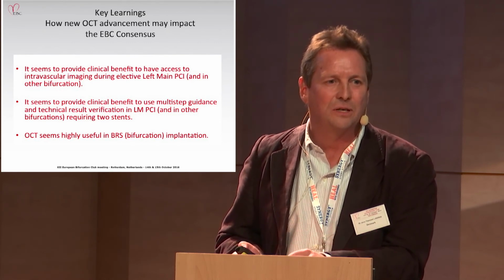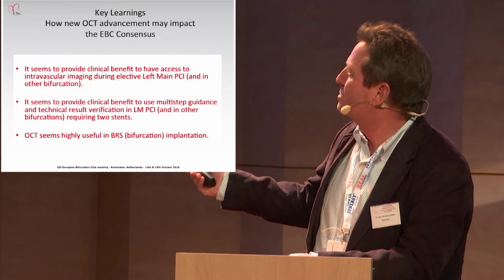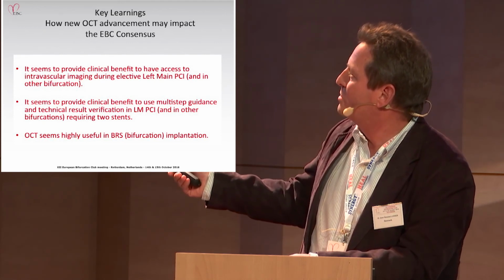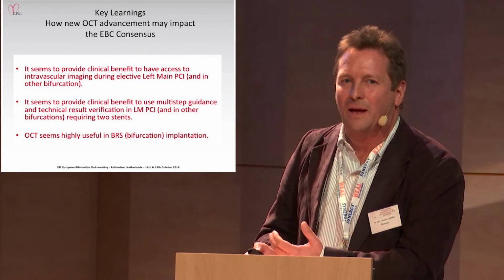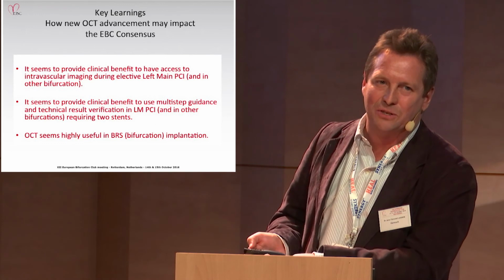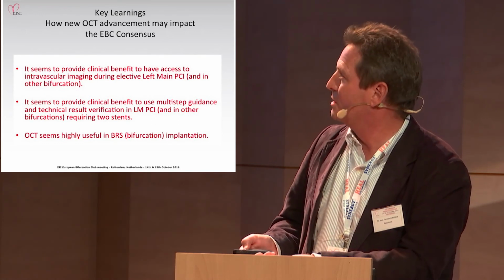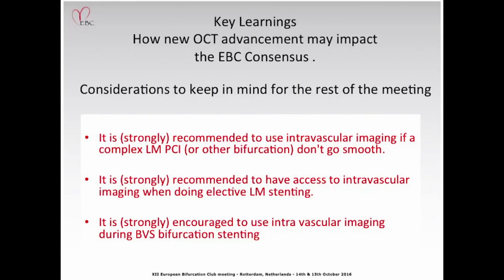procedure if we have seen these images. It seems also to provide clinical benefit to use multi-step guidance and technical result verification when we require 2 stents. And at least it seems highly useful in BRS bifurcation implantation. We have not been discussing that much in this session, but of course it would be an area where it could be promoted. Again, consideration to keep in mind for the rest of this meeting. Have it in your mind and try to see where we can fit these recommendations in the new consensus.